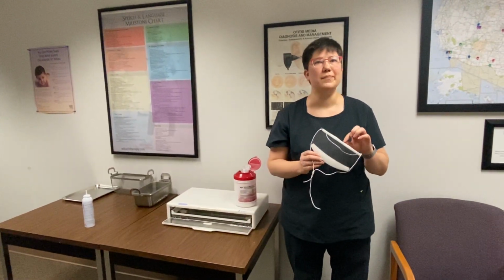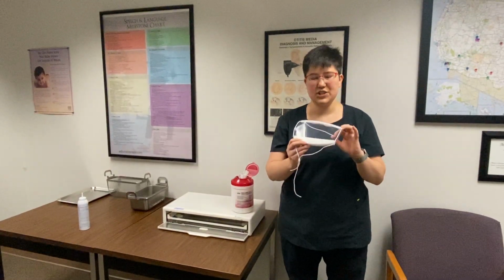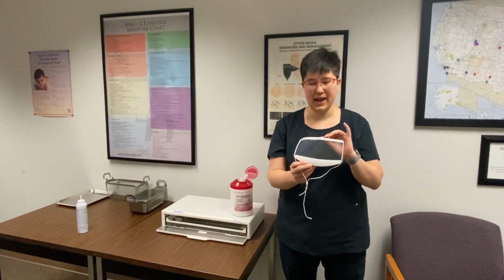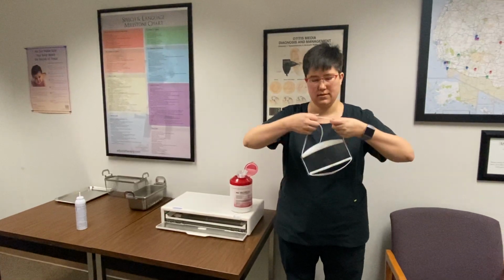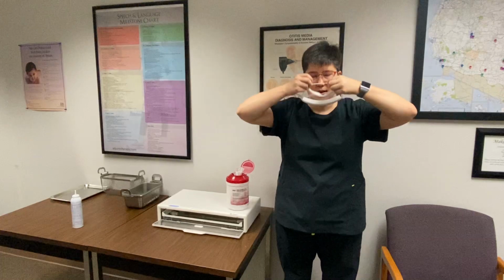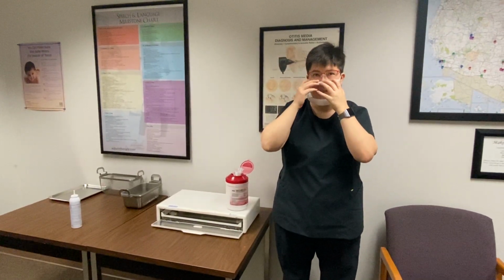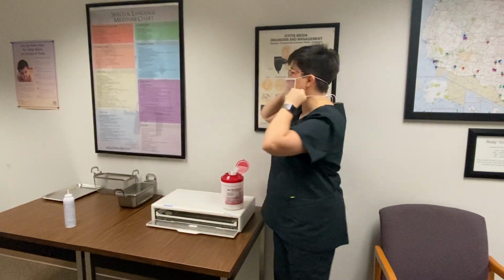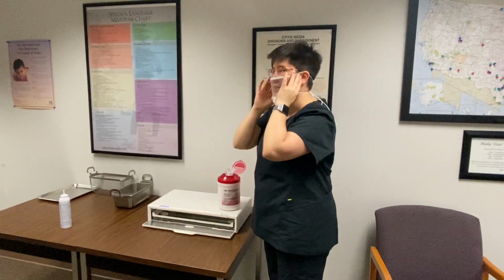Okay guys, we're going to do the best we have with what we actually have. So each of you will be issued one singular clear mask. They get put on by putting the thing like this, and then you put it up, and the foam fits firmly and contoured around your nose and the chin. See how it's loose though? You tighten it up until it's firmly here.